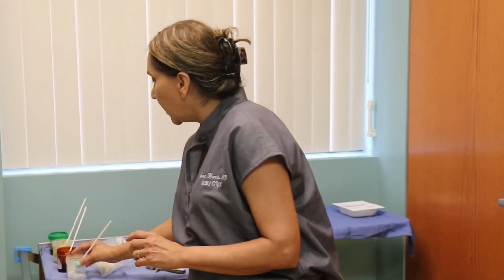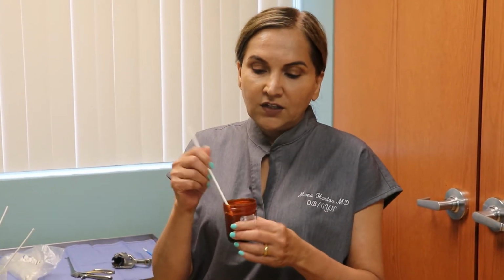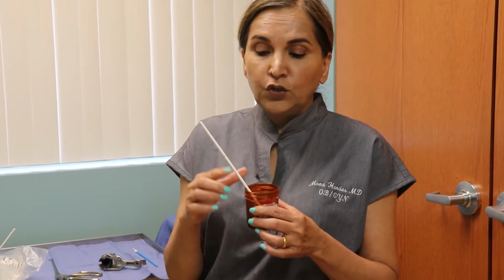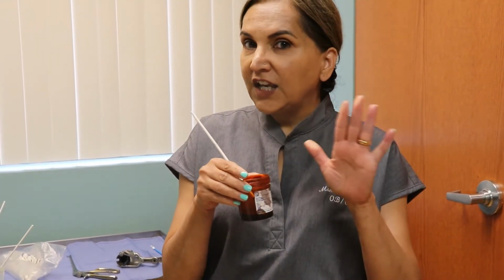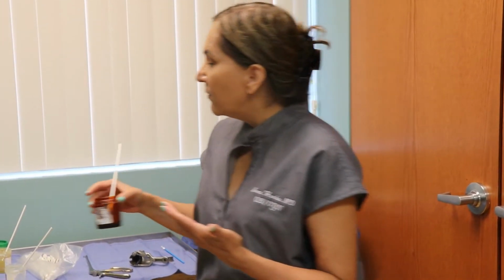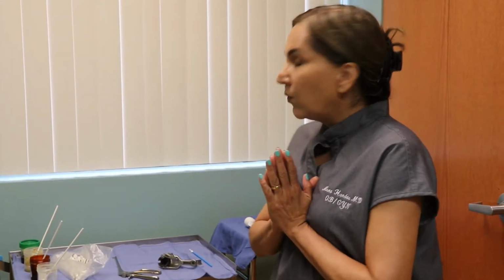We also use another chemical called Lugol's iodine. It's like a dark brown. What it does is that the normal cells are dark brown, but the abnormal cells are like a yellowy or very, very light brown. So it also helps me find out the abnormal areas. So once I see the abnormal areas, we're going to have to make sure what kind of abnormality you have.